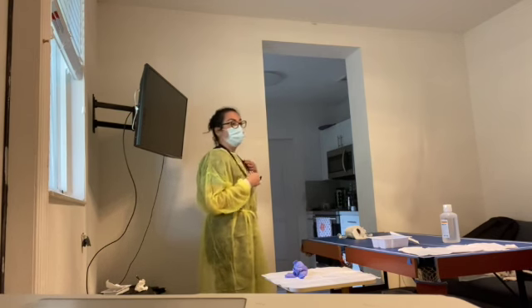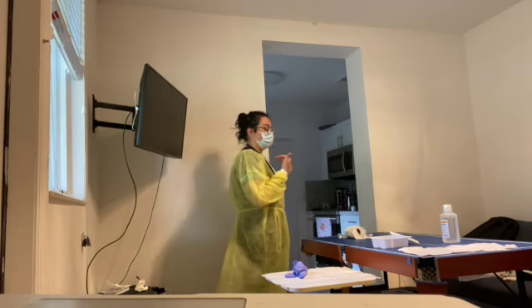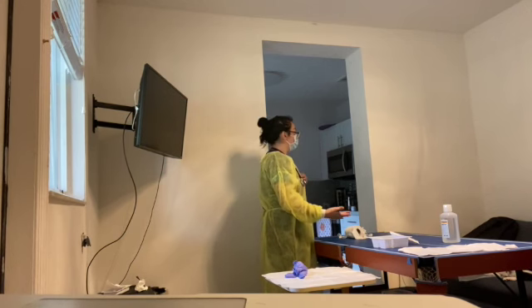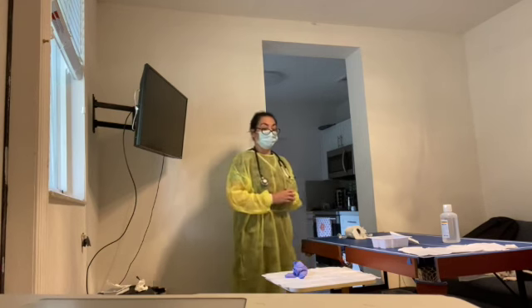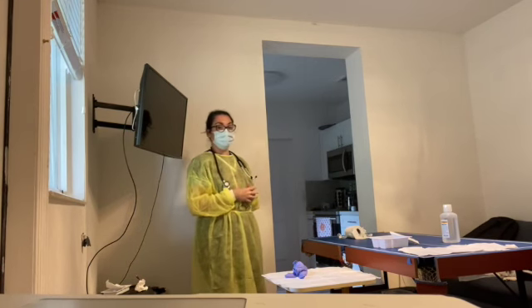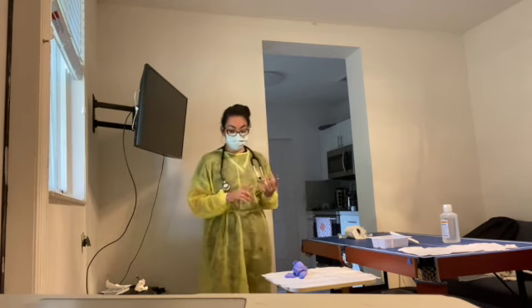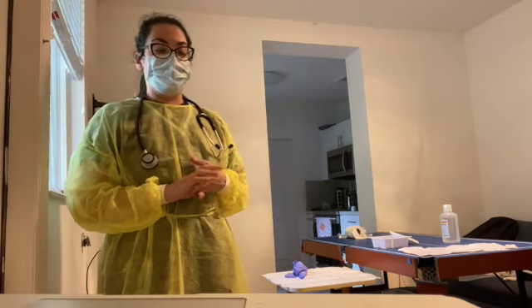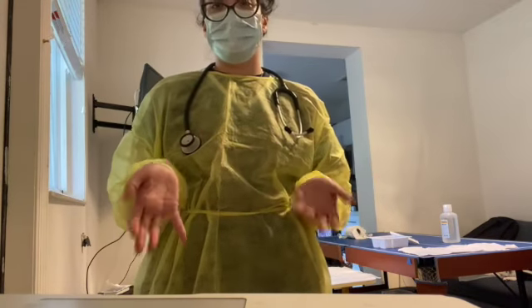At that time, I will wash my hands and don new gloves, and I will assess the patient's vital signs again, and I will also auscultate the patient's anterior 6 lung sounds and posterior 8 lung sounds. And once I have assured that the patient is in good health and there are no complications with this, I will document any of the drainage color, odor, amount, and if it was occluded in any way, and I will let the provider know, and I will dispose of my PPE materials as necessary.